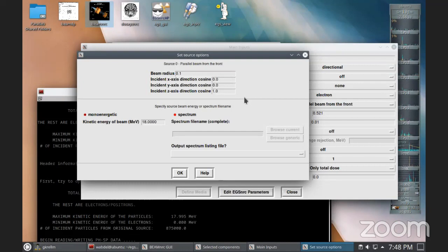So we try to guess, we try to think, okay, maybe that, maybe this, and so on. And at the end, what we look at is the output. Because we cannot measure the dimensions of the target or the flattening filter, but we can measure the PDDs and the profiles, and that will be our judgment on whether our model is acceptable or not. So always put that in front of you. You want a model that can predict accurately the data that I've measured.